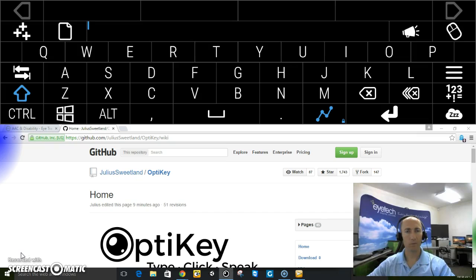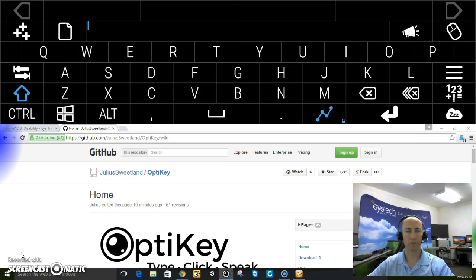The OptiKey software is great. Has a great on-screen keyboard, great computer control, mouse control, and also has speech output. So I've already calibrated. Let's go ahead and get started.